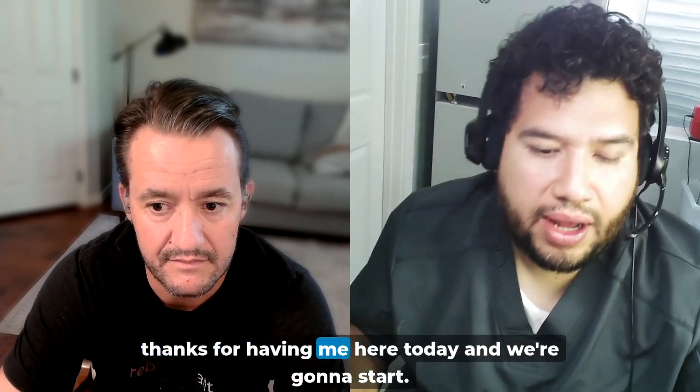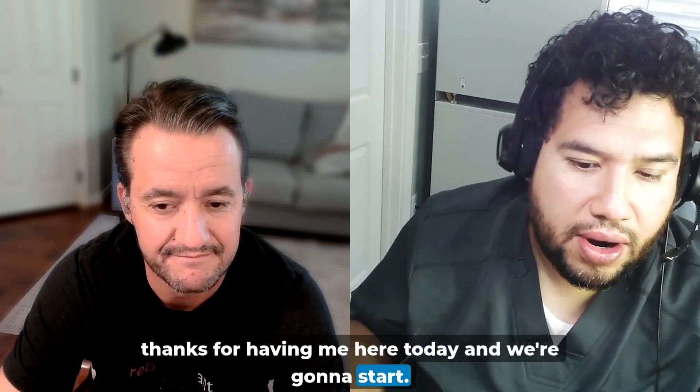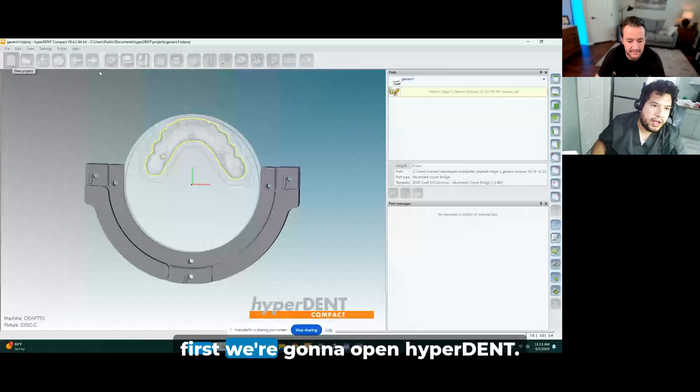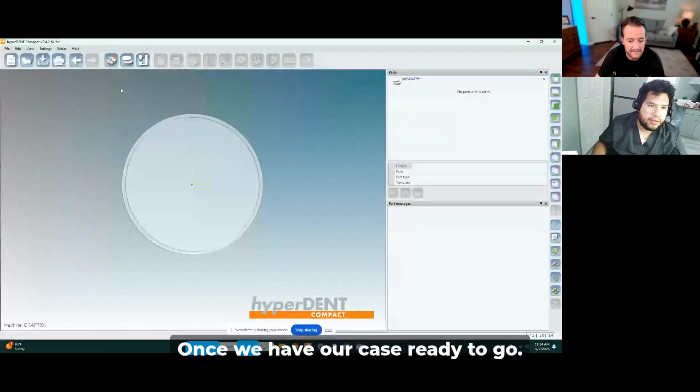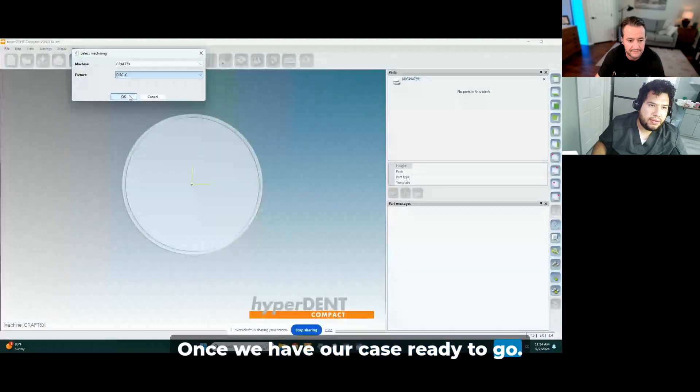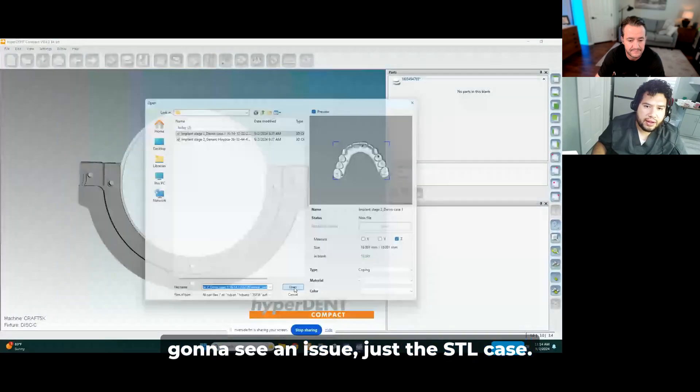Hi Rob, thanks for having me here today. We're going to start, so first we're going to open HyperDent. Once we have our case ready to go, we're going to see an issue, which is the STL case.